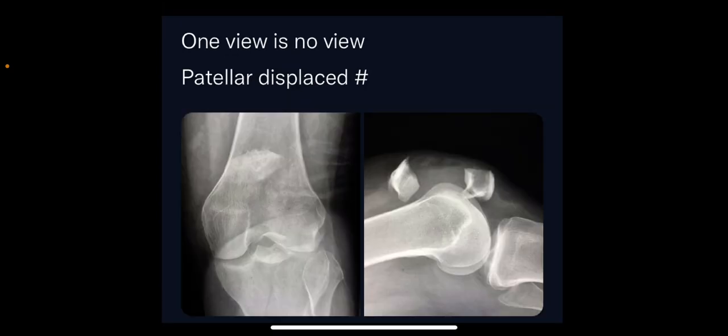Another example is a displaced patella fracture. On the AP view, the distal fragment of the patella is completely overlapped and not clearly delineated as it overlaps over the tibia. Looking at the proximal fragment, one might think that is the entire patella, only mildly superiorly located. On the lateral view of the knee joint, you can appreciate the fluid level as well — joint effusion is present — and the displaced patella fracture is clearly seen.